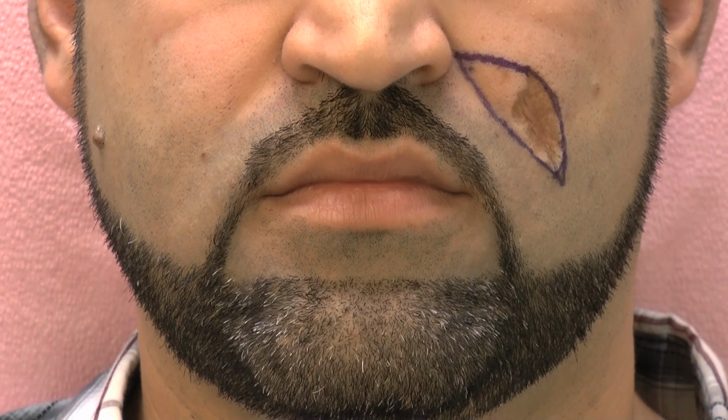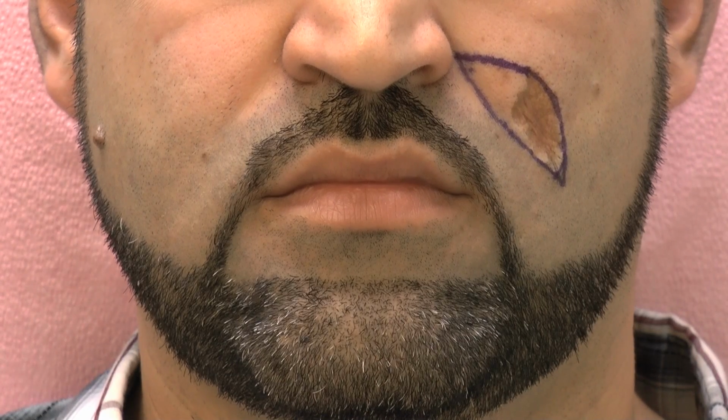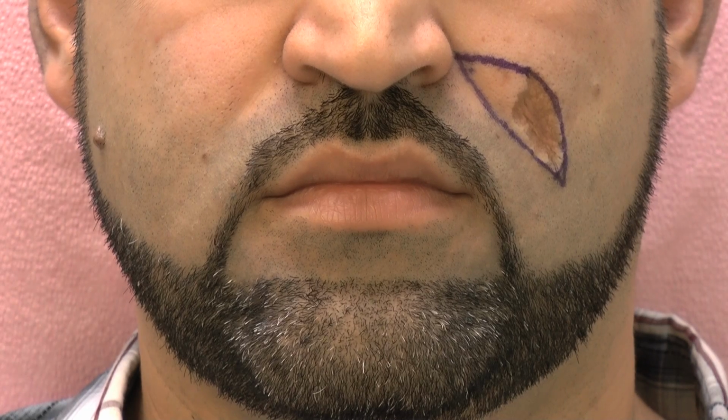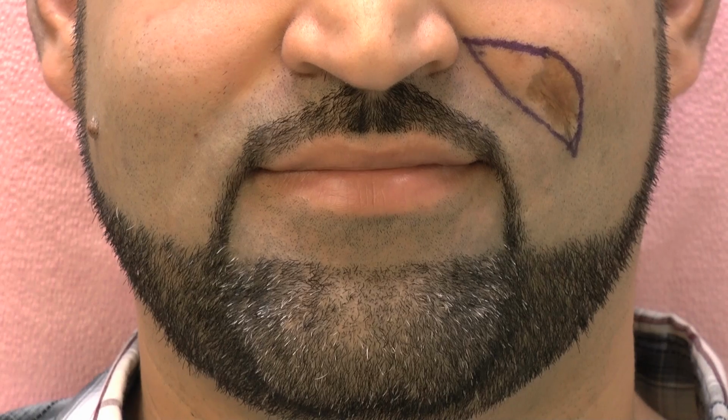And the markings are critical where we do not take too much of the skin and we are just barely touching the boundaries of the scar itself. It's also important to have the patient smile and see how it fits into the smile profile. Could you please give us a smile? So you can see that it falls into it very nicely, and I'm making a point to make sure that this falls right in the depression of the superior part of the nasolabial groove.